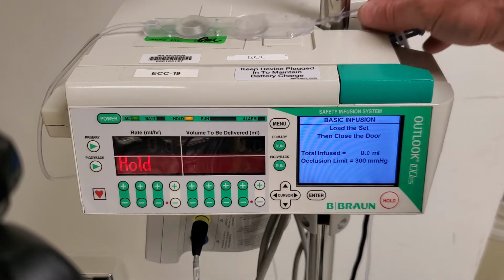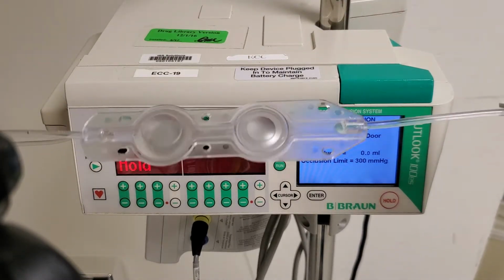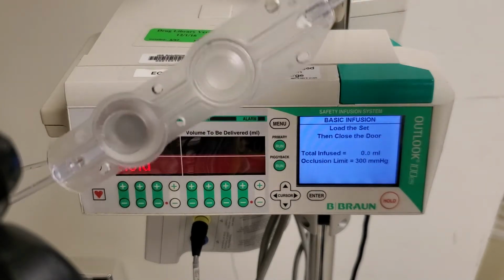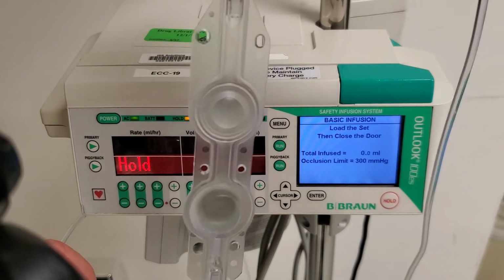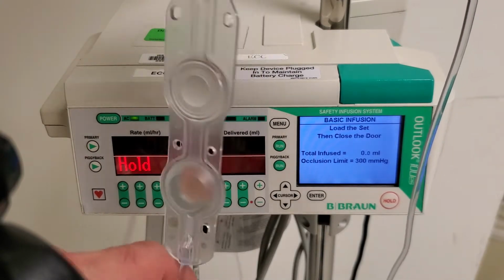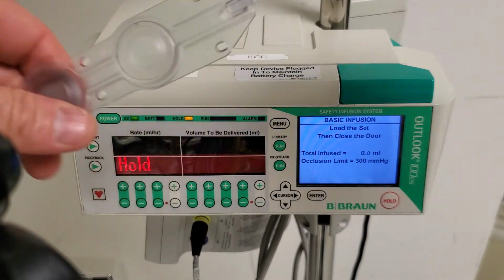So the first step, after you've chosen what mode you're going to use, is to load the pump set. Pump set has to be run through with fluid, and you have to get the air out. Best way to do that is to hold this set upside down so that the fluid comes in from the bottom, forces the air out the top.